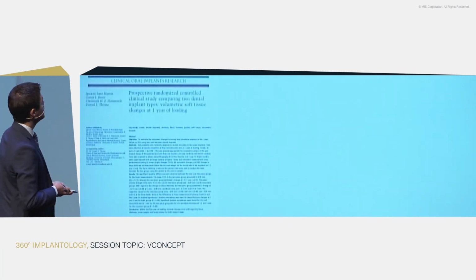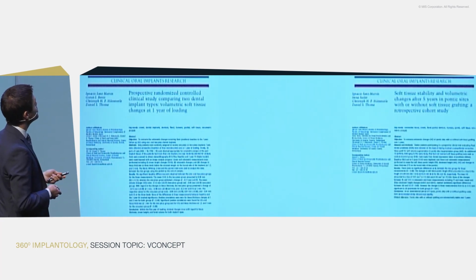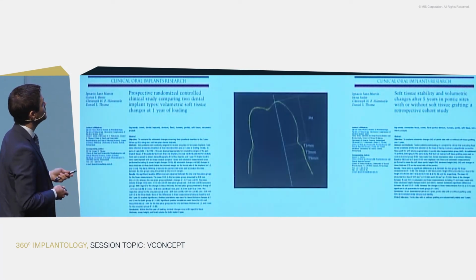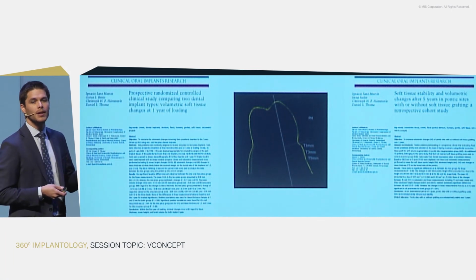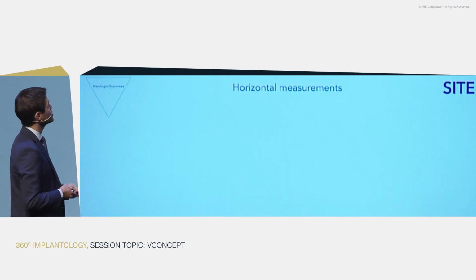This is not something that we've just come up with. This is something that we've published, both in a pontic study published in 2016 and around implants published in 2015, with a very similar measurement design, where we have a longitudinal slice and we measure at the level of the gingival margin and at different levels below. So let me share with you the values of these horizontal measurements.